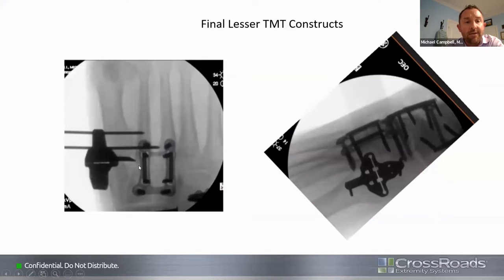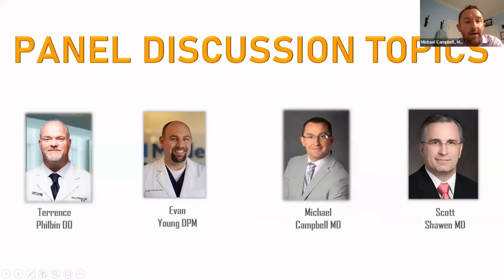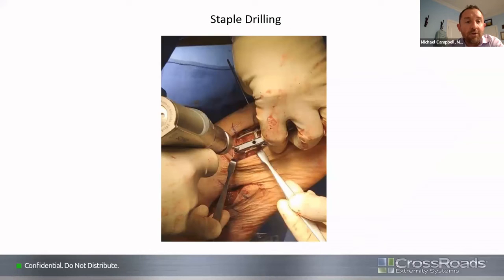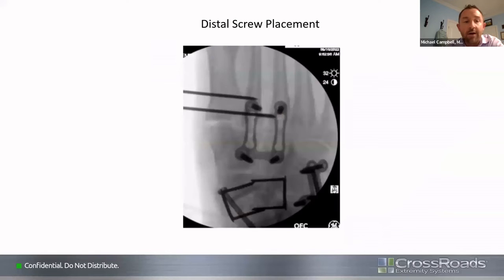And I think this is a perfect example of how beautifully these plates are engineered and how nicely they fit the metatarsals. You can see they slide right in there. And then you come back and you can do your dynabunion as well. This gentleman as well had a bunch of hindfoot arthritis that you guys saw earlier. This is his fixation. Off topic a little bit, but I love when I do my triples for the CC joint, they make this Z-shaped plate.